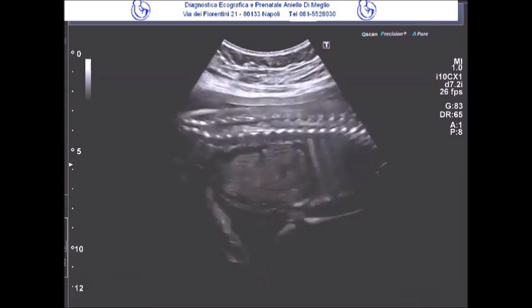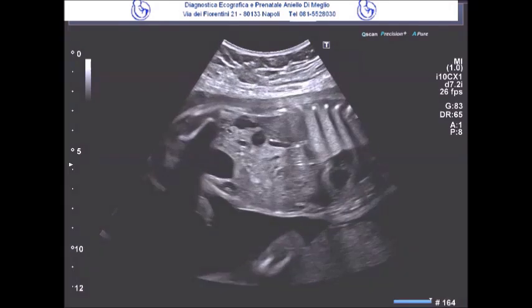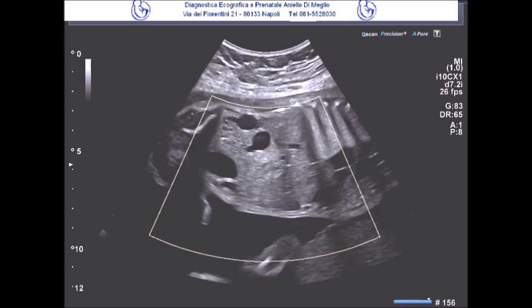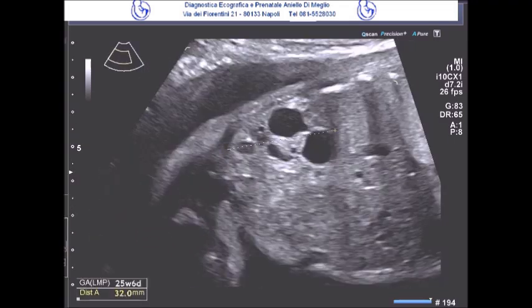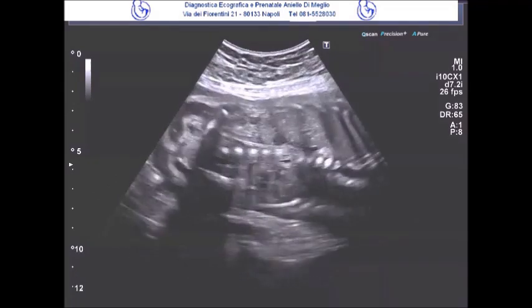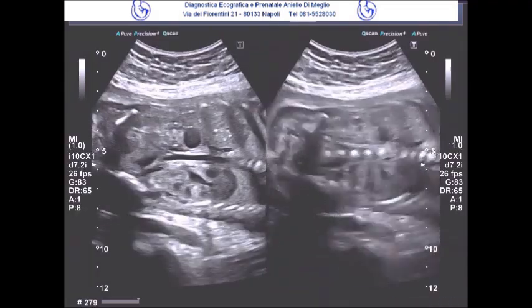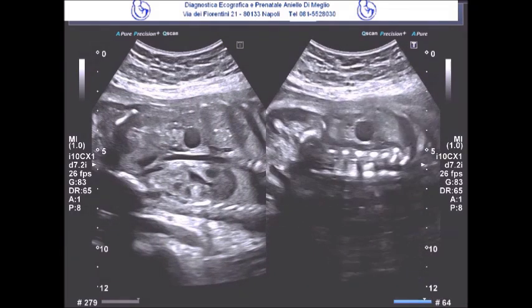Meanwhile, as we will now see in the images of the right kidney, the ultrasound examination findings have changed significantly. In fact, we can observe that compared to the previous check, the right renal parenchyma now appears to be affected by two distinct and separate cystic formations for the most part, with the remaining renal parenchyma appearing to remain largely unaffected. The two distinct cystic formations have also been evaluated, let's say, in the coronal plane scanning view, and here we will also see a detailed dimensional assessment of them.